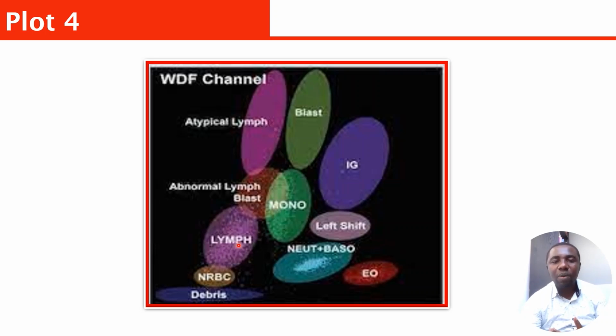Now, if it runs from here and up to here as well, you might be looking at lymphoblasts, as the case may be. Now, if it is monoblasts, you're going to see something shifting up to this point, okay? So this is some of the things you need to also understand, especially if you're working in the lab. This is not just for people looking for a job, okay? This is also for people who are already working in the lab. So you put all this into consideration before making a decision.